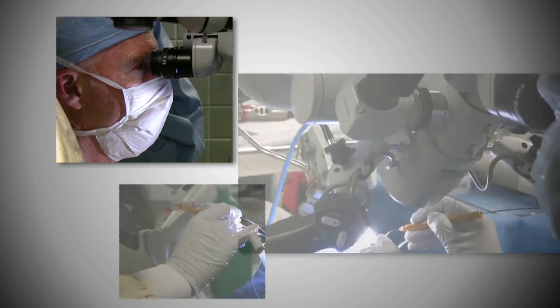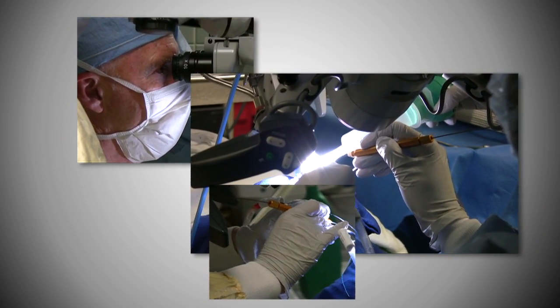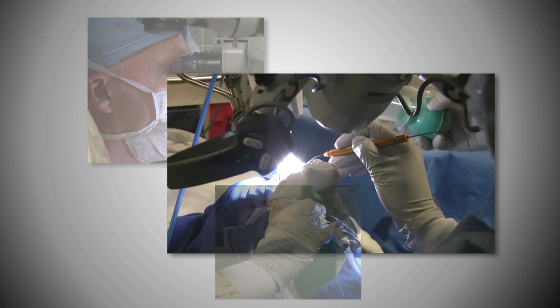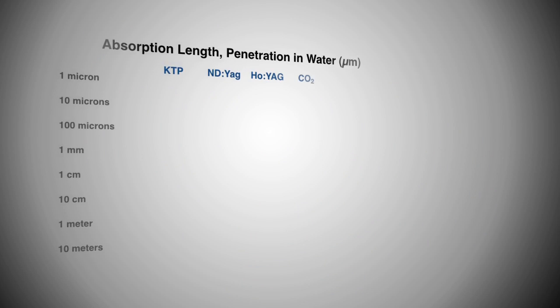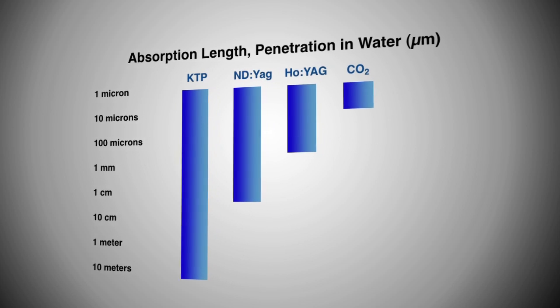The laser is a natural tool to cut scar tissue. The laser of choice would have to be the CO2 laser because it does get absorbed completely into soft tissue, and therefore it causes the least amount of collateral tissue damage.